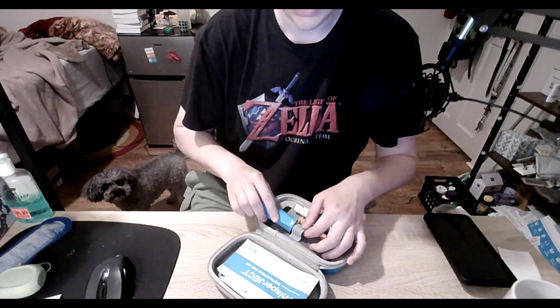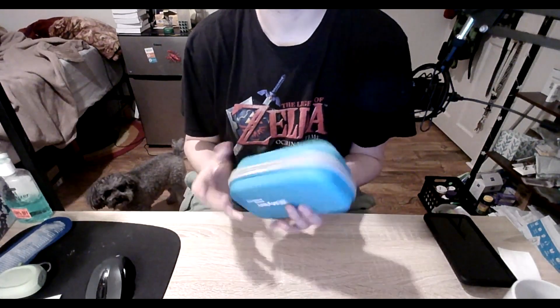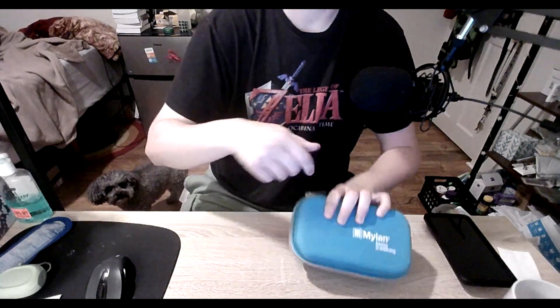But yeah, that's the autoinjector. It's pretty easy to use. Of course, there are warnings in here that you should be aware of. This also comes with a nice little carrying case that you can use for your injection supplies. I'll have a link to more information on this.